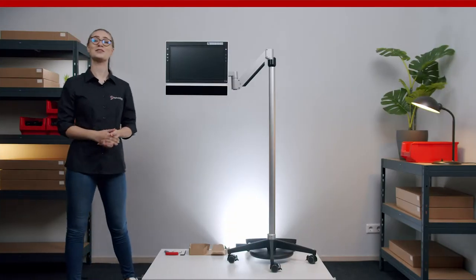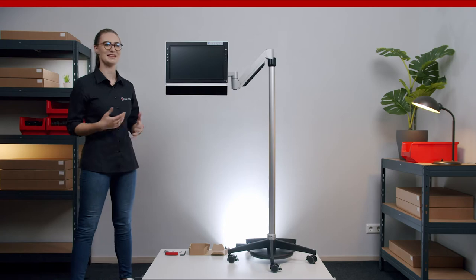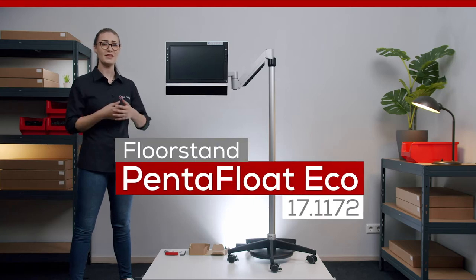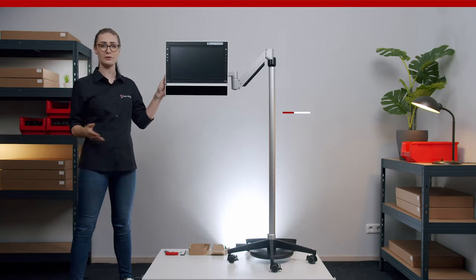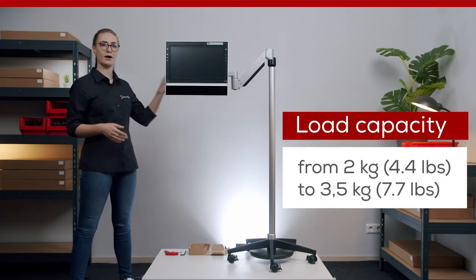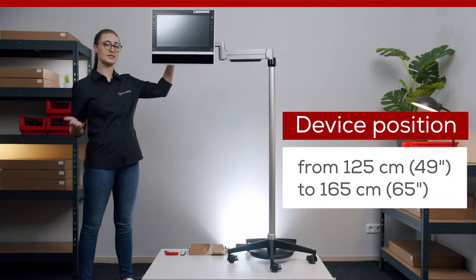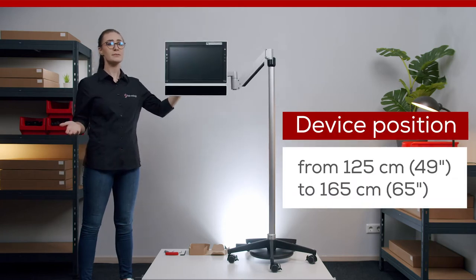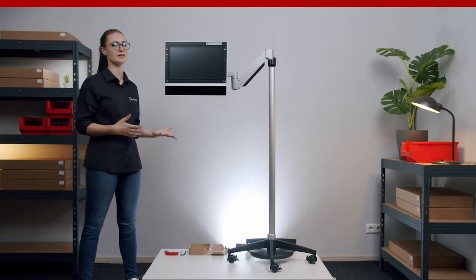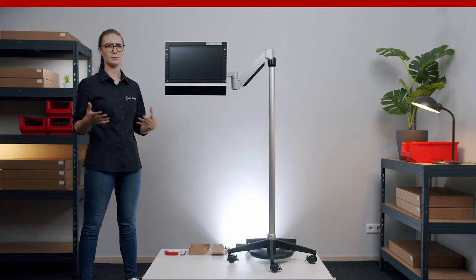Hi, my name is Lara from Readapt and welcome to this episode of Mounting Made Easy. Today we are going to show you how to assemble and adjust the Pentafloat Echo floor stand. This floor stand can hold devices with up to 3.5 kilograms or 7.7 pounds and features a floating arm and a small base with a counterweight. The device can be held at a maximum height of 165 centimeters or 65 inches, which makes the Pentafloat Echo the perfect solution for positioning communication devices over hospital beds, especially if there is not much space in the room.